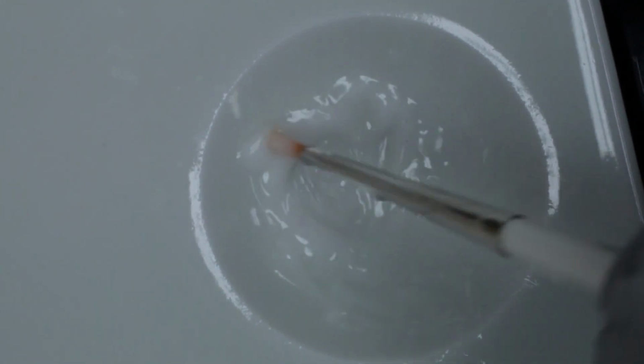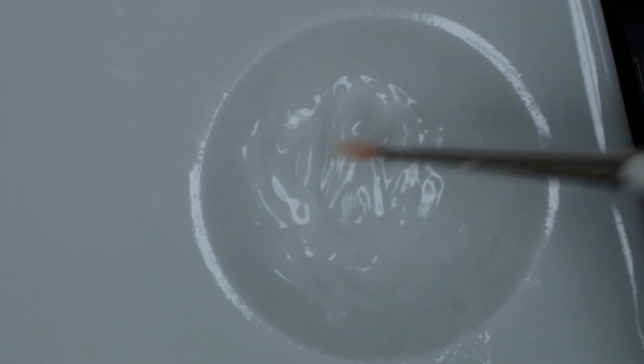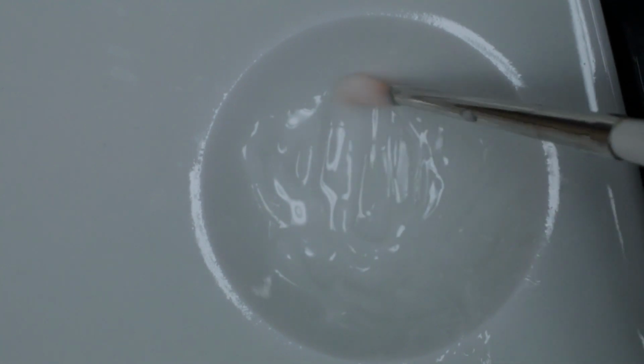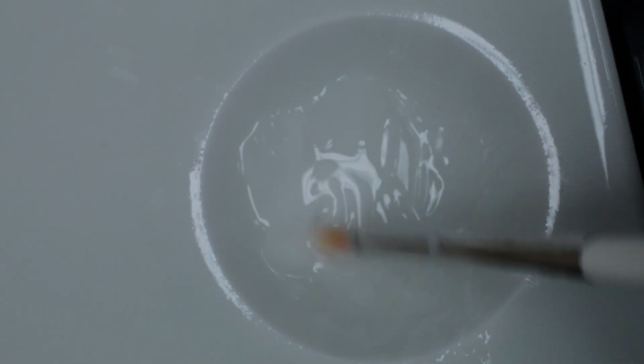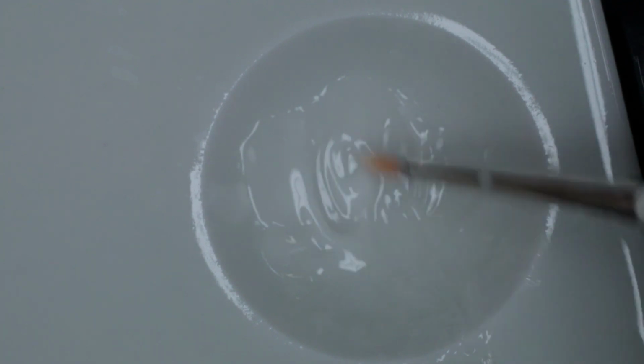All right, so here I have some of the glaze already mixed up. It's not a bad consistency actually. So if it was a little thicker, I may be thinking about adding some diluting liquid. I want something that paints on to the crown pretty easily. I don't want it so thin or runny that it doesn't stick well. That's kind of not staying in place.